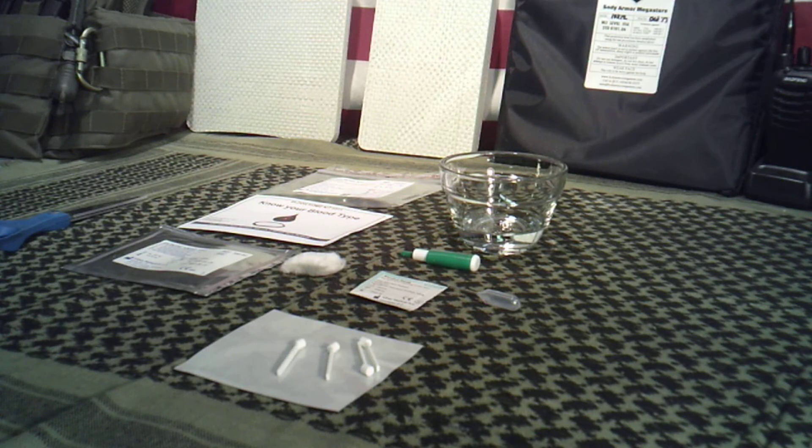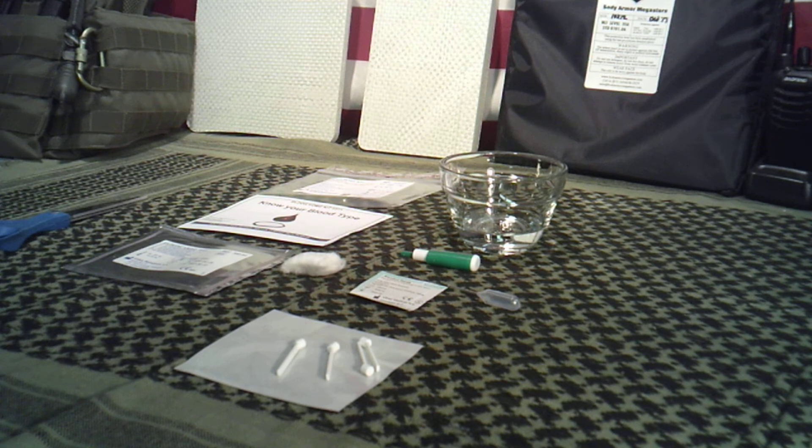Welcome to Guns and Gear Network everyone. I appreciate you tuning in today. Today's video is about home blood type test kits.